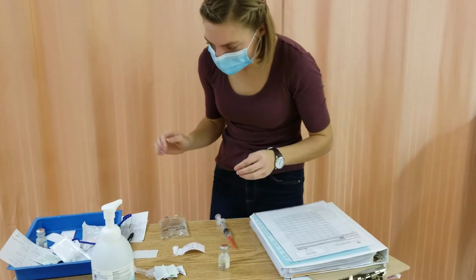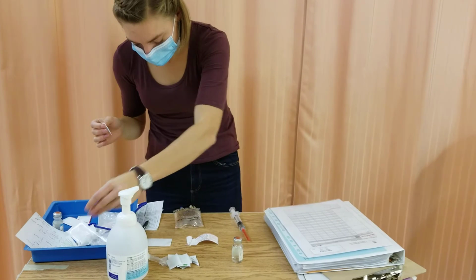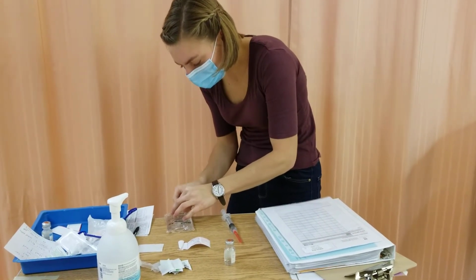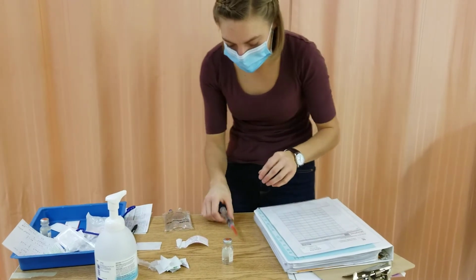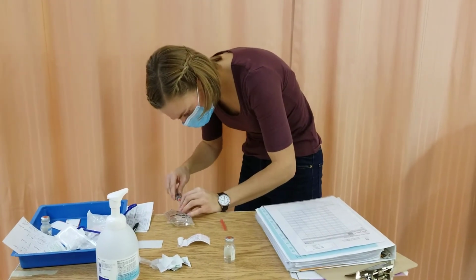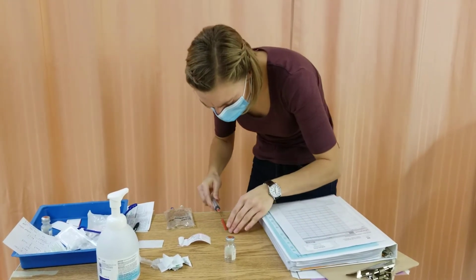So now I'm going to take a swab. Clean the port for 30 seconds, let it dry for 15. And I'm injecting my medication into here. Okay, so I've now successfully got the medication in.